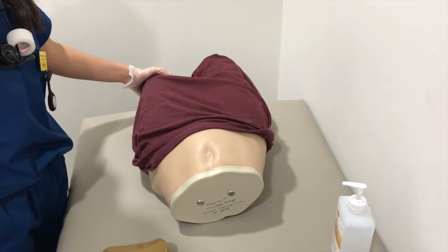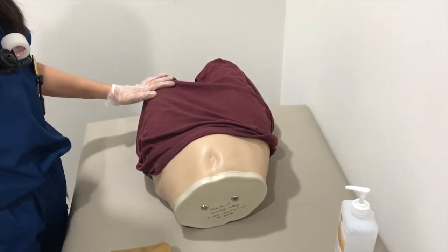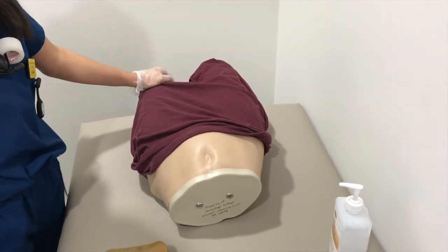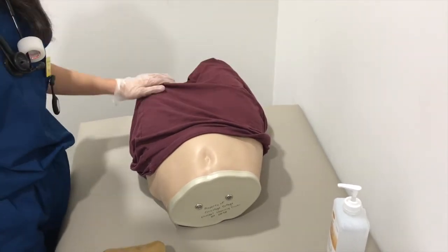Okay, so next I'm going to do the IM medication administration. Again, it's going to be 1 milliliter of sodium chloride. Dwight, I hope that you're okay with that. I know that you're getting poked a lot today.